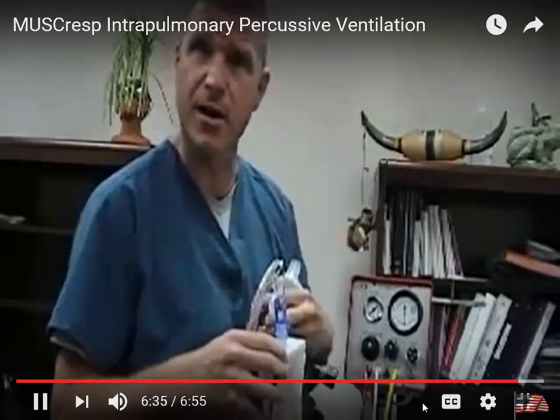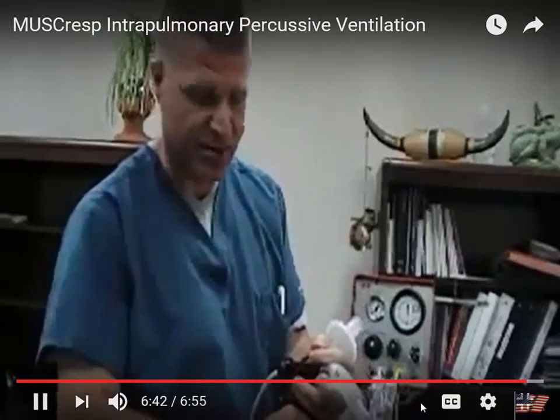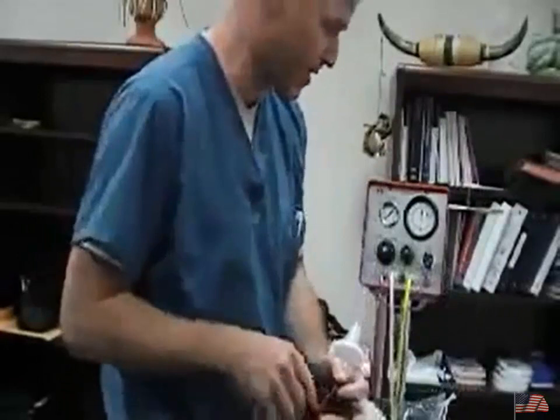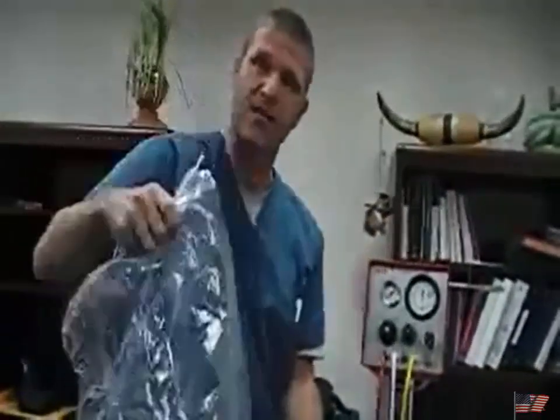Then we'll reinflate the cuff, check a good cuff pressure, put them back on the ventilator and do a full ventilator check, all right. Now, clean up on this machine, we would disassemble it, rinse it with sterile water, and then I would put it in a patient sterile bag, okay? When the bag gets nasty, you just get a new bag. Okay? And that's our IPV treatment.